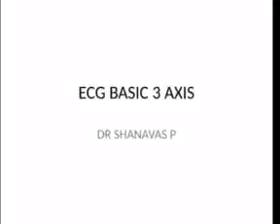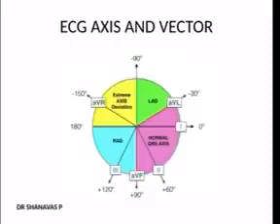Today we will be discussing the axis of an ECG, that is, how to determine the axis. We won't be going into the whole details and theory behind that. Our only aim is to master or understand how to determine the axis of an ECG. You might be very familiar with this very colorful picture.